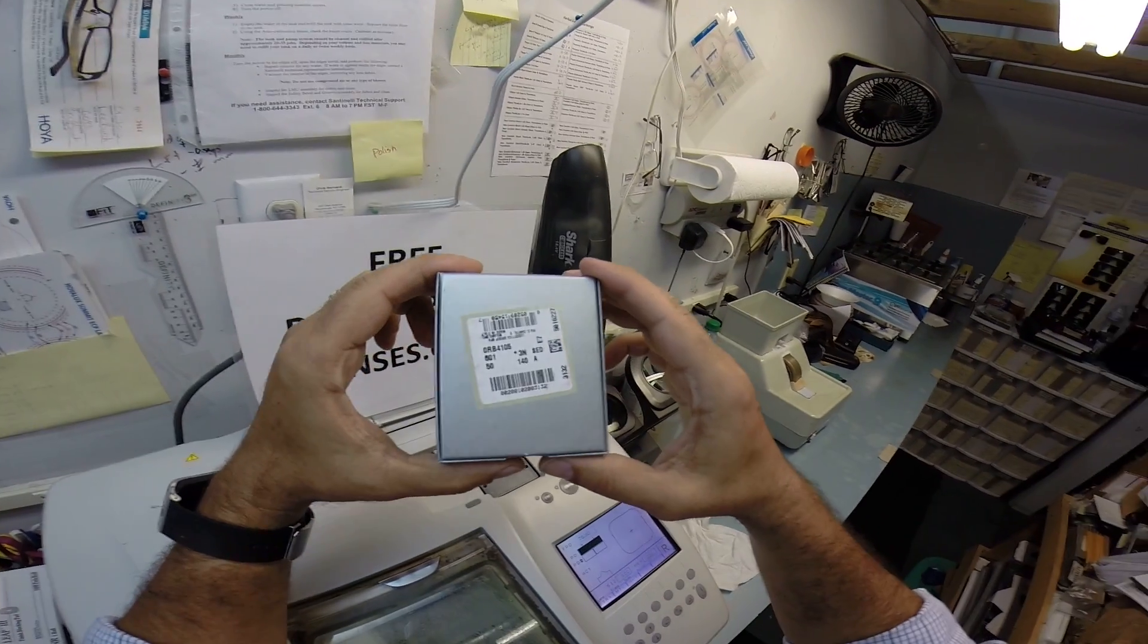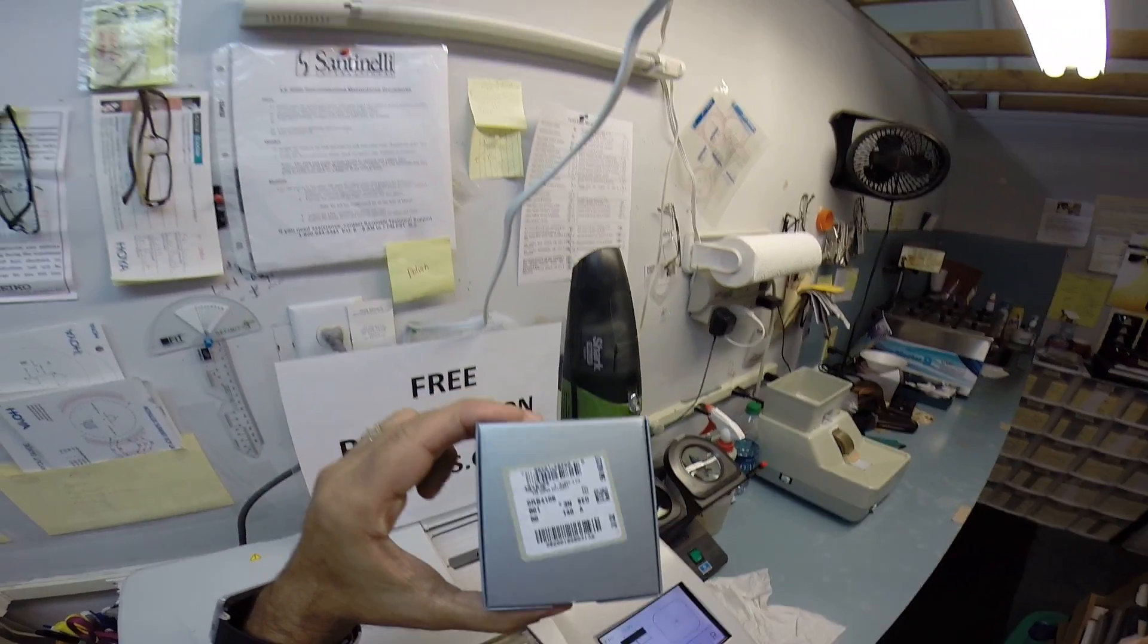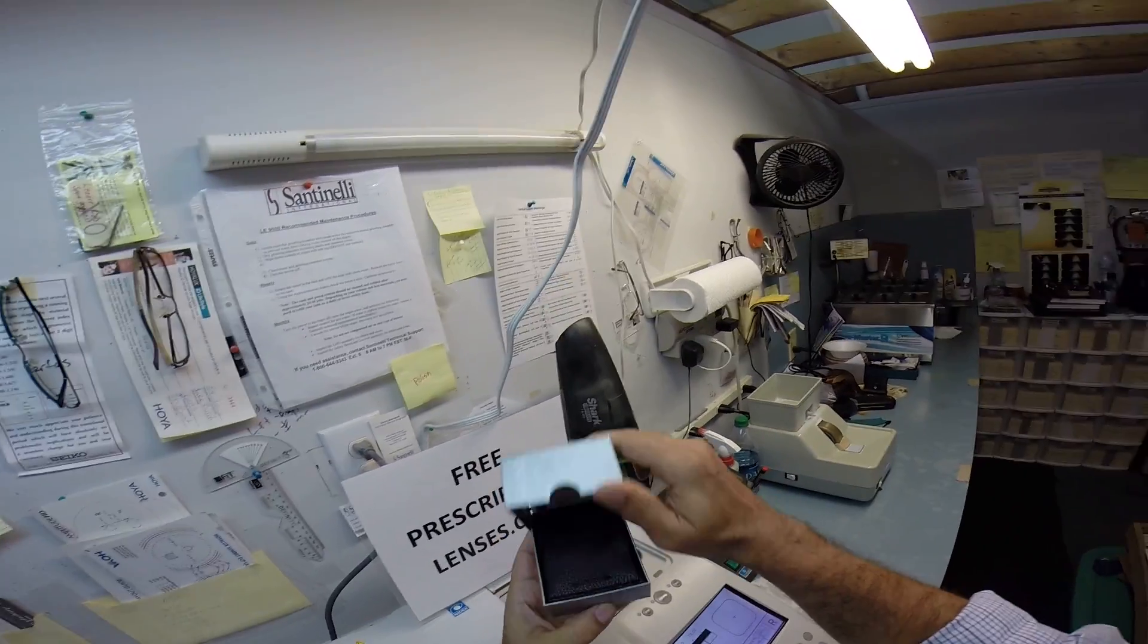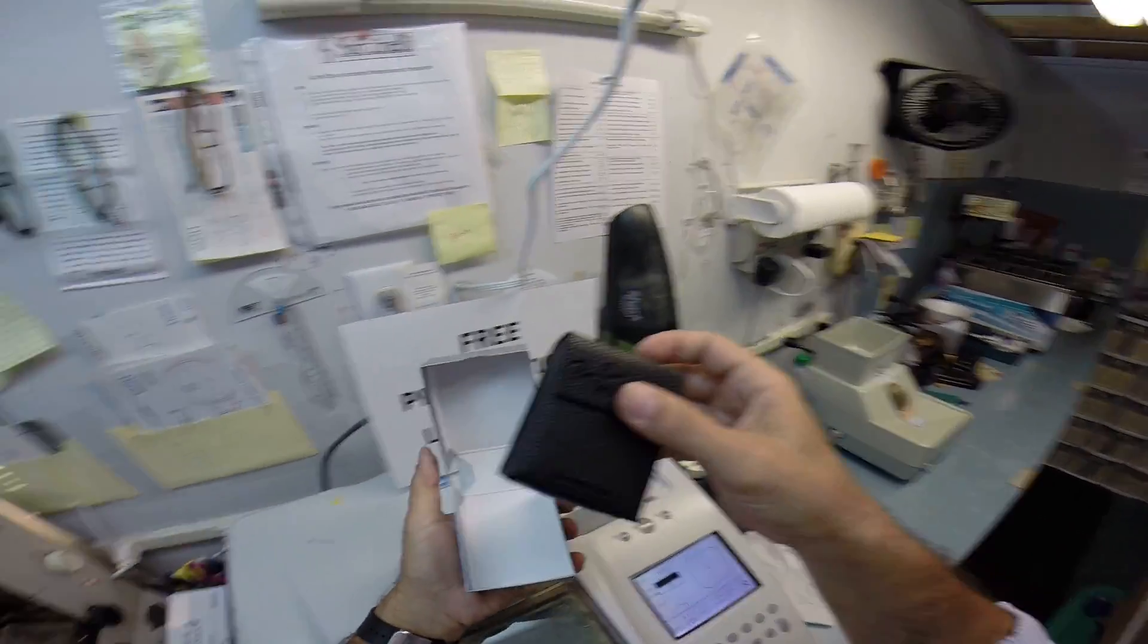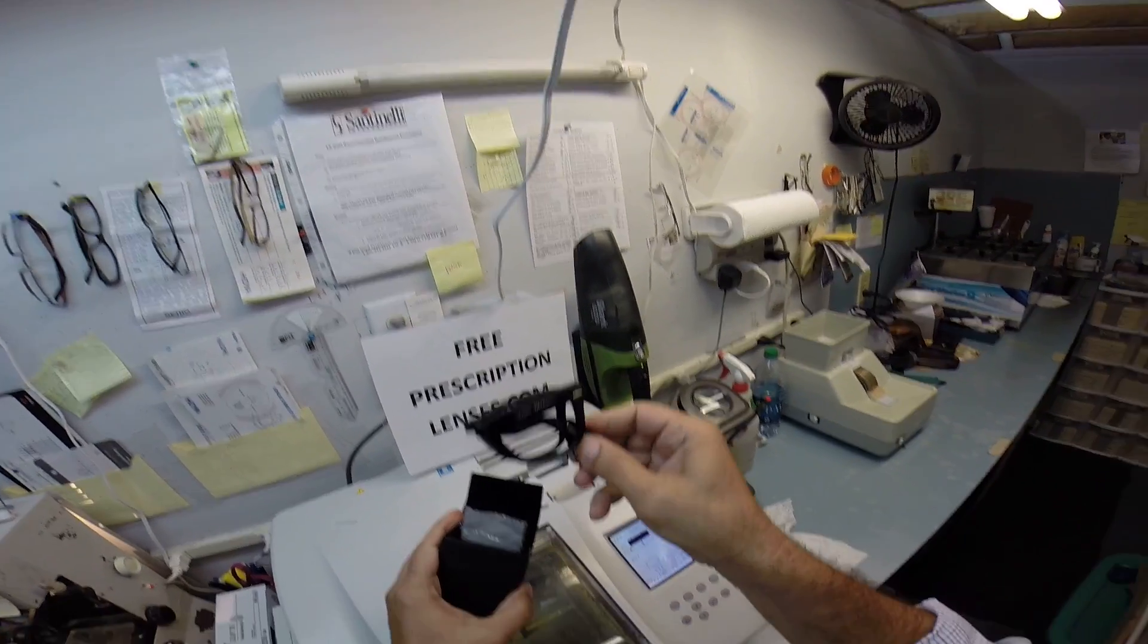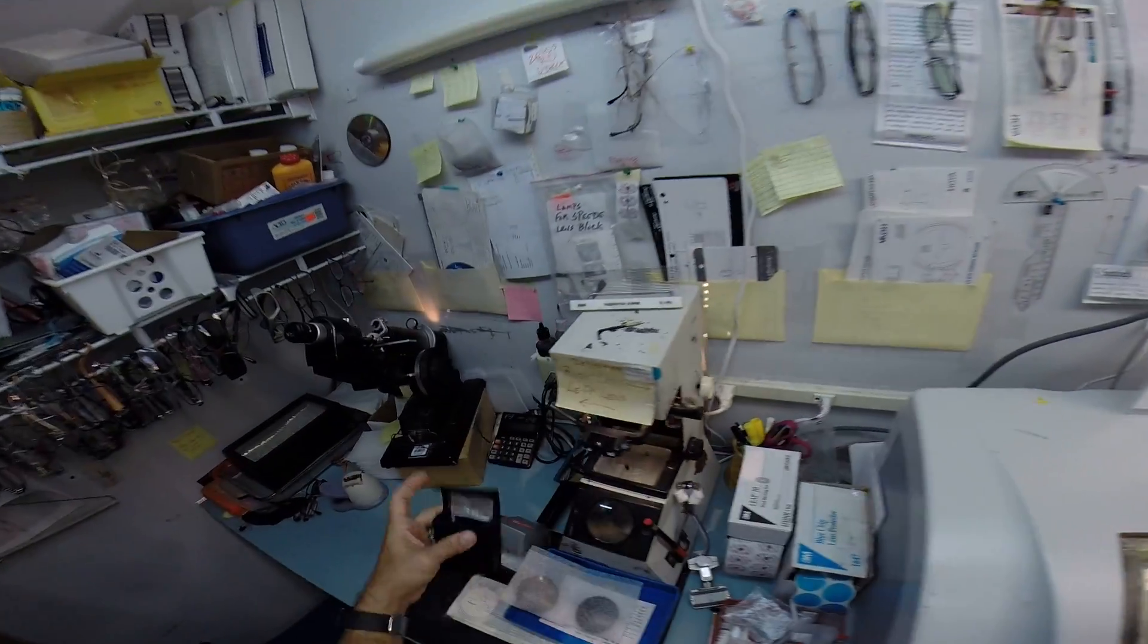There's only one frame that can be in here and that is the 4105 Folding Wayfarer, color 601 in the 50 eye size. And believe it or not, Randall, this came in this cute little case. Let me take it out. Of course, your Folding Wayfarer, your Ray-Ban cleaning cloth and your Ray-Ban case.